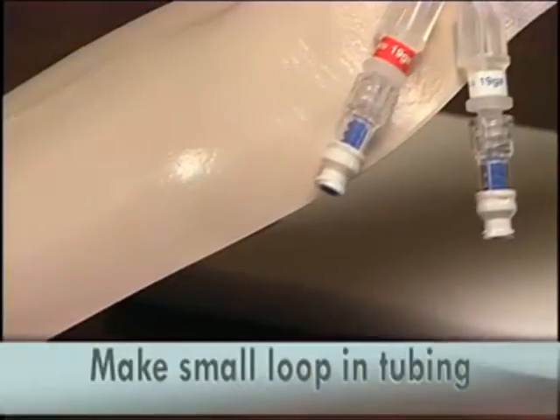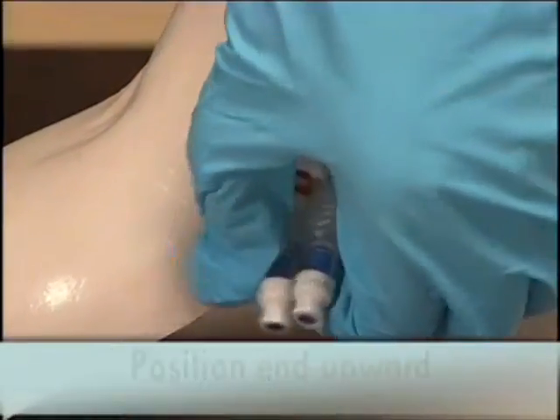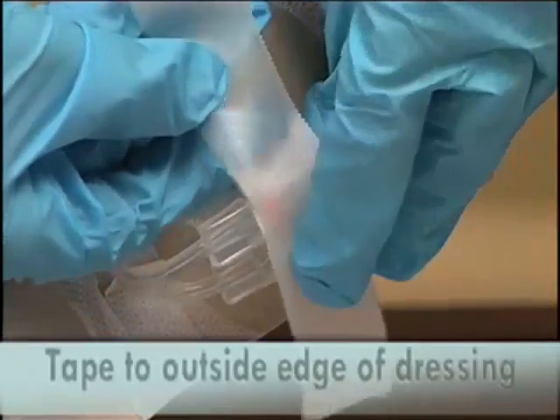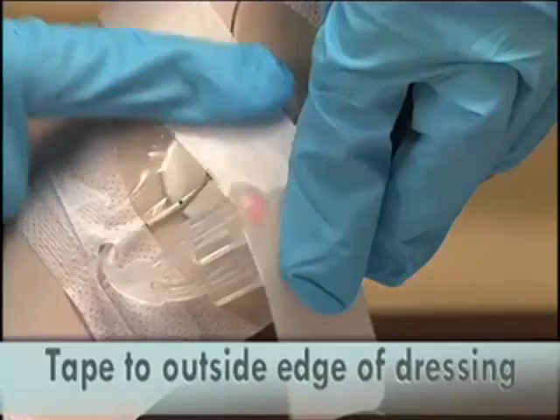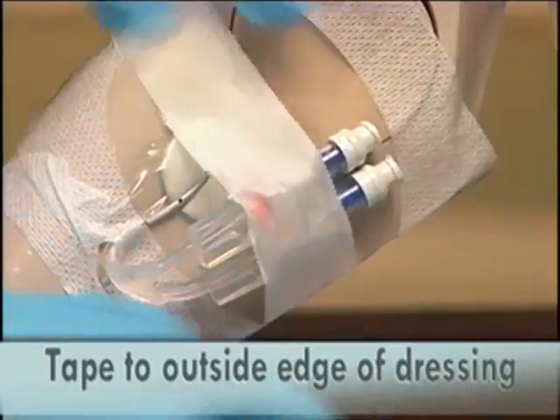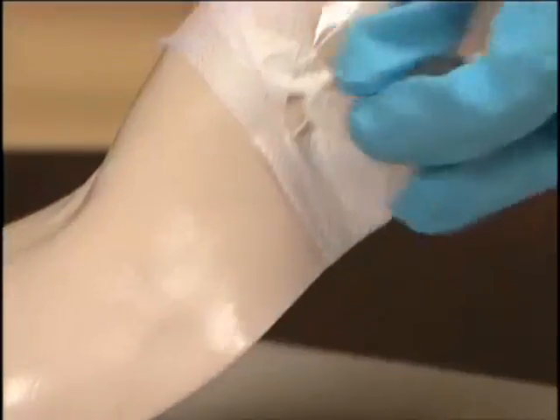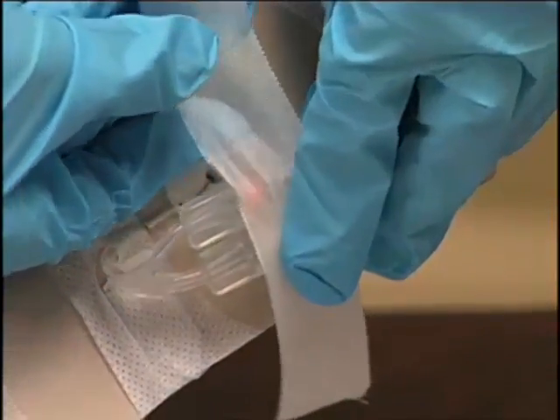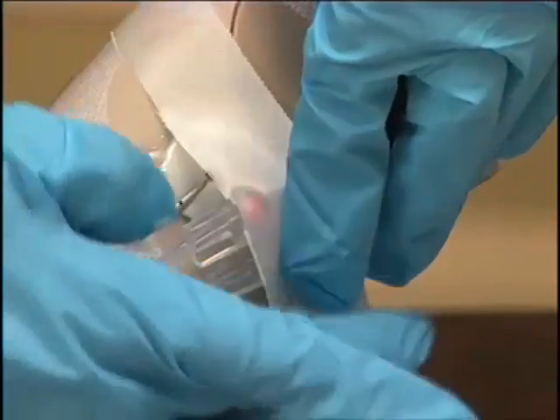Make a small loop in the tubing and position the ends to face upward. Tape it onto the outside margins of the dressing so there is less tape on your skin. This will secure the tubing to help prevent excess tension on the tube and reduce the risk of dislodgement.